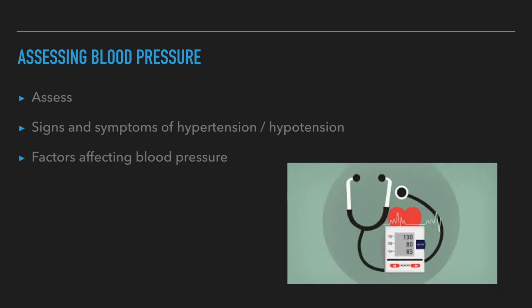1. Assess blood pressure on initial client examination. 2. Identify factors that may alter blood pressure: medications, exercise, age, emotional conditions, smoking, postural changes. 3. Assess best site for obtaining blood pressure. 4. Review previous blood pressure readings, if available. 5. Consider any factors that limit site selection, like mastectomy, dialysis access, PICC line.